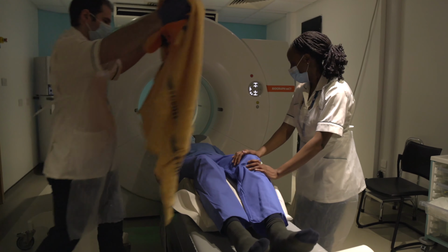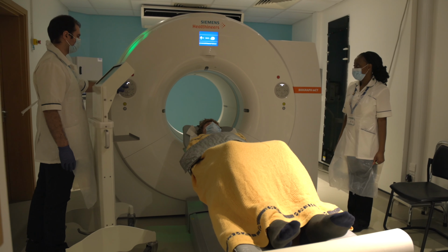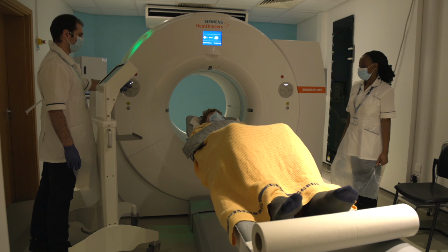We use X-rays to create a 3D picture of the structure of the inside of the patient, and then we use the PET scanner to take a picture of the function, the information we get from the FDG, and see where the sugar has gone.